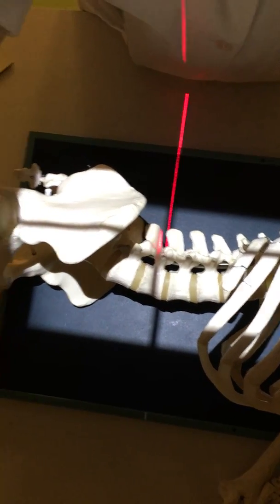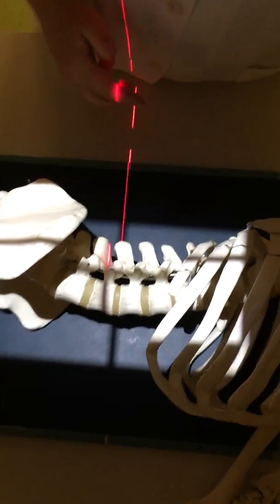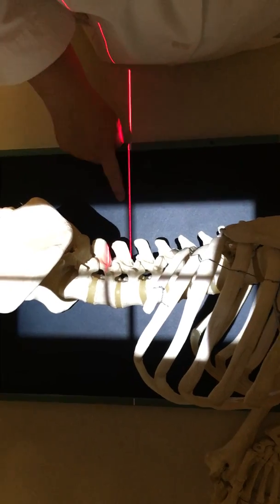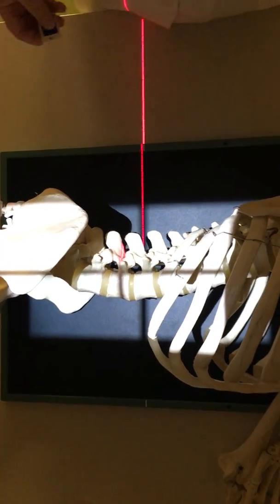This setup here is to show you that there's plenty of room to include the entire spine with 8 inches wide. As you can see the light field posterior, I've got lots of room from the posterior border of the IR, of the collimated border to the spine, and the same thing with the anterior portion. There is plenty of room.